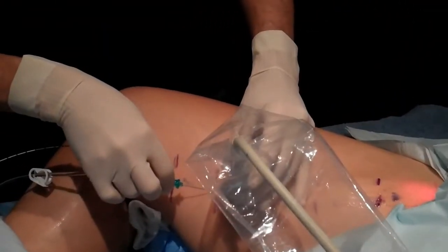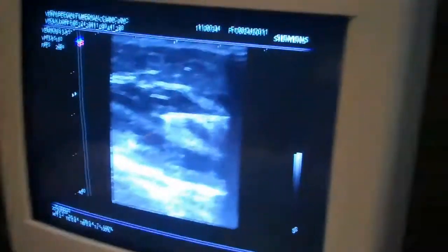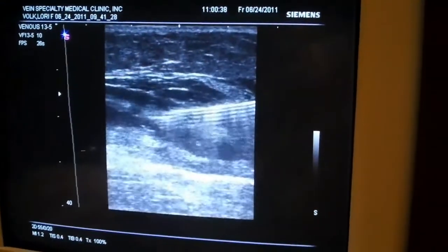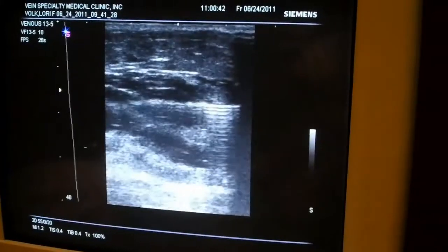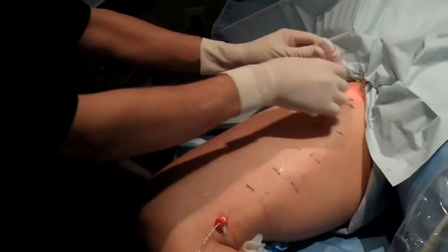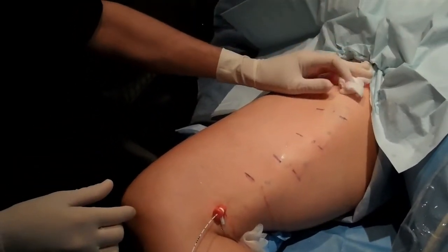Now I'm giving tumescent dilute anesthetic using a pump around the vein before we start the laser. In the middle of that line, that is the laser catheter, and I'm giving fluid all around it. The catheter is in position and all around the vein there is tumescent anesthetic, so she should not feel anything.